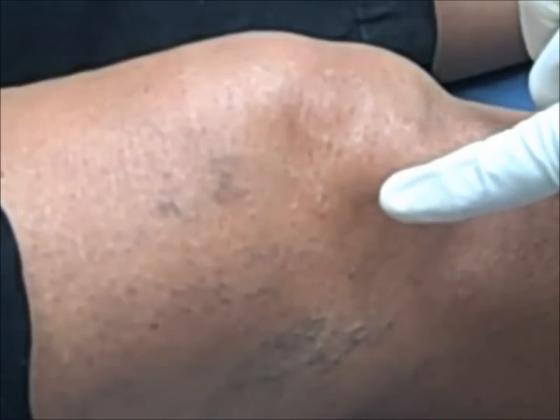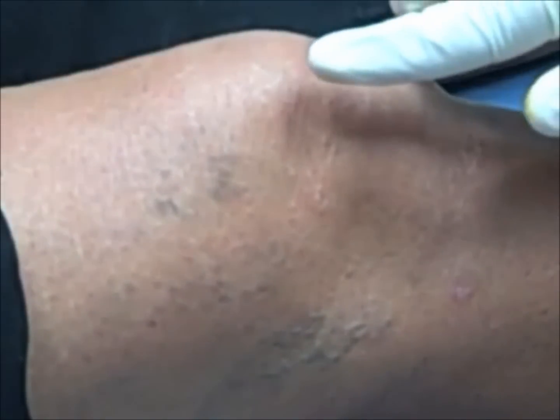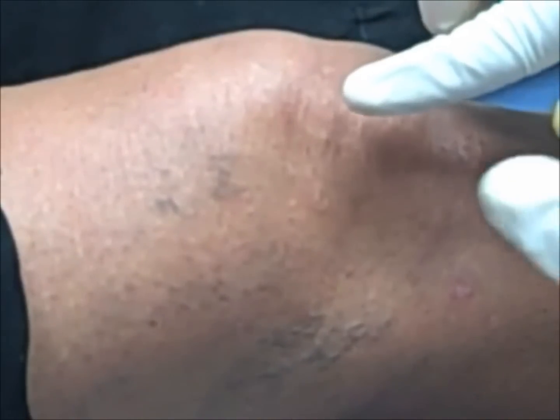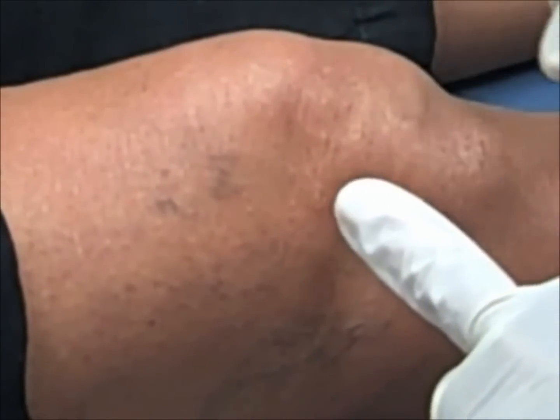With the patient in a supine position and the knee extended, we will identify the important landmarks for the procedure. For this approach, the main landmark is going to be the superior and lateral aspects of the patella. Once you've identified those landmarks, we'll identify the injection site, which is approximately 1 centimeter down from the superior and lateral edge of the patella.